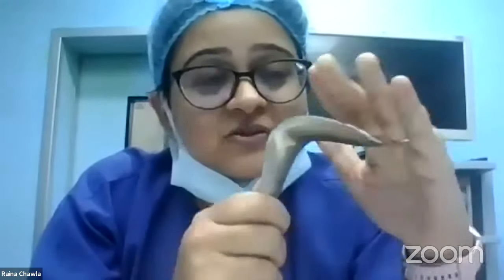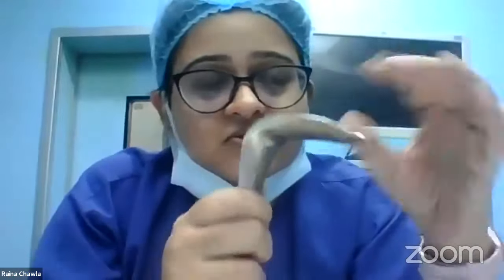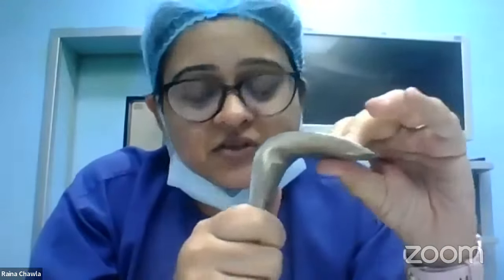A common question that I was asked during my postgraduate days was, especially in colder climates, what will you do? Because it's made of stainless steel, it is an uncomfortable procedure for the woman. So always try to warm it up in your palms and then introduce it. Otherwise it will be very cold, especially in winters. Small things the examiners may ask you, for those who are interested to know a little bit more.